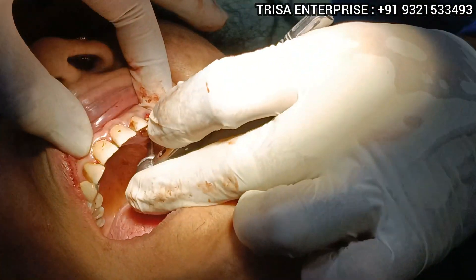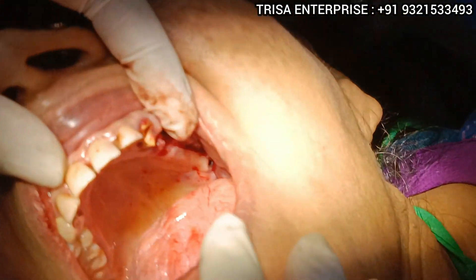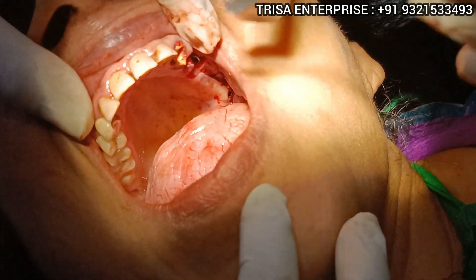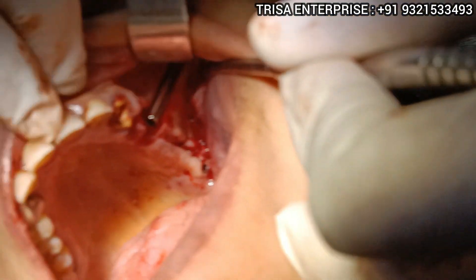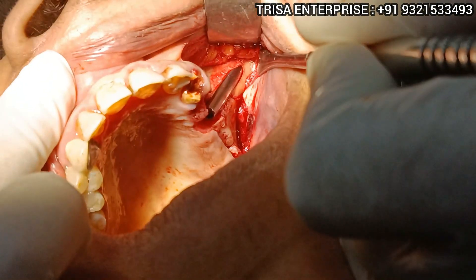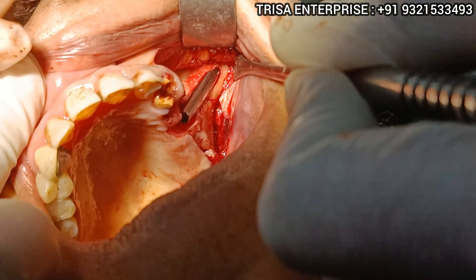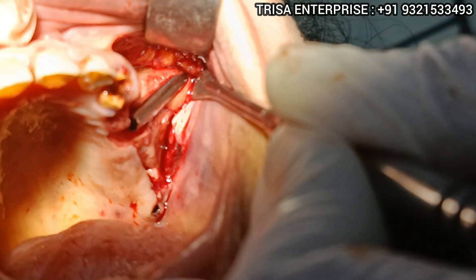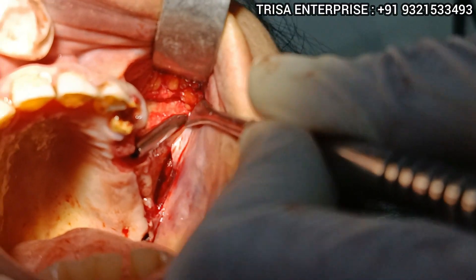You can see the nice placement of the zygomatic implant. Can you appreciate the placement of the zygomatic implant? This is the first one.